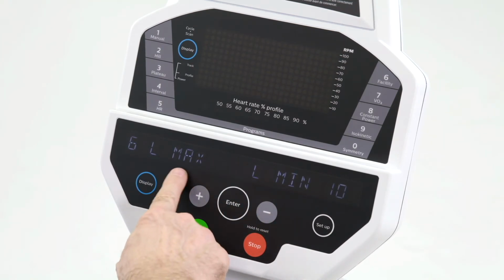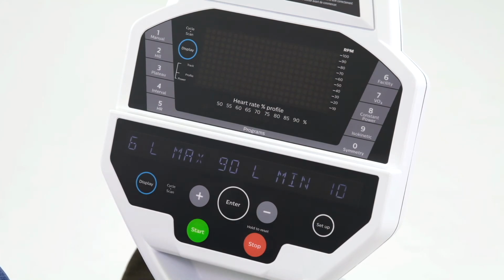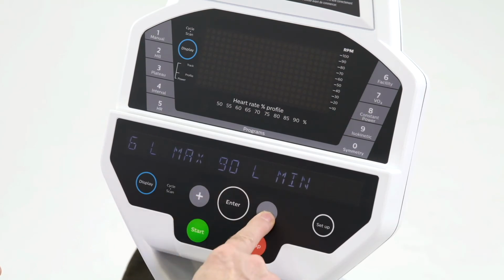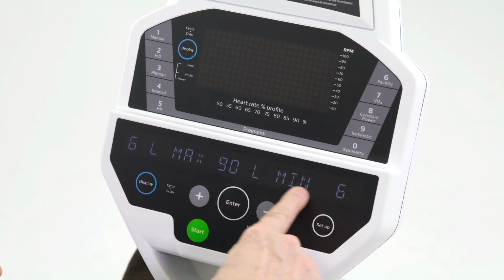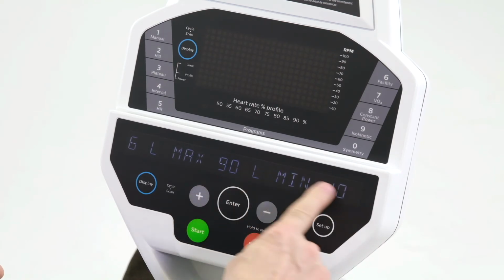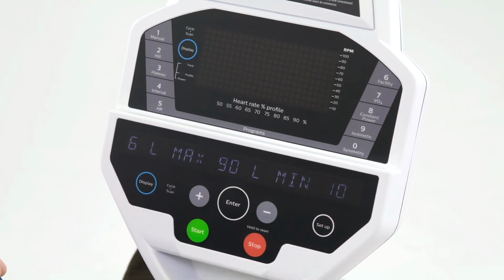If your patient has a maximum flexion of 90 degrees, we can enter that, and then if their minimum flexion is about 10 degrees, we enter that. So this patient has a functional range of 80 degrees, and what we're able to do now is calculate what this patient's seat position should be based on the height we entered, and what the crank position should be based on the patient's range of motion.